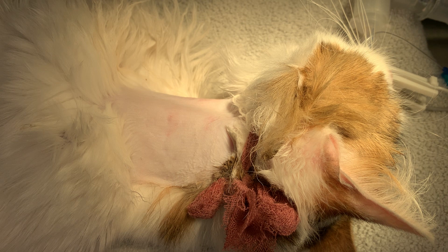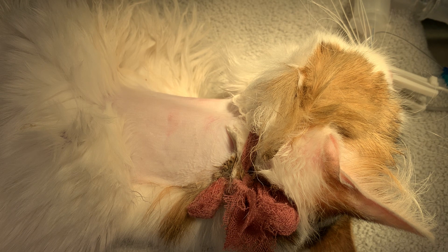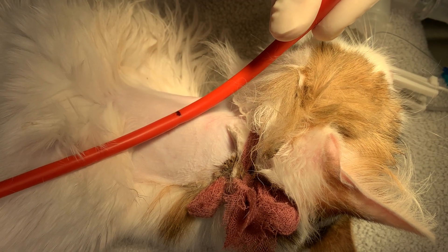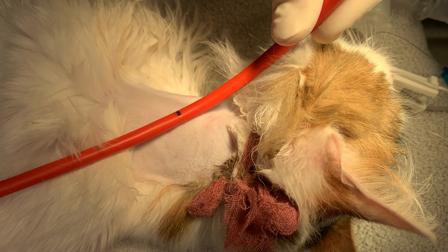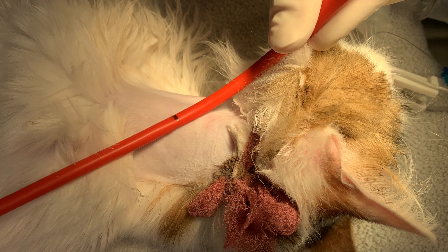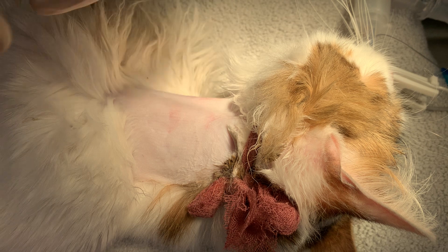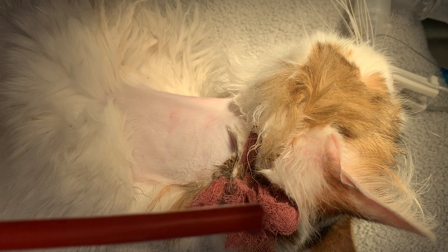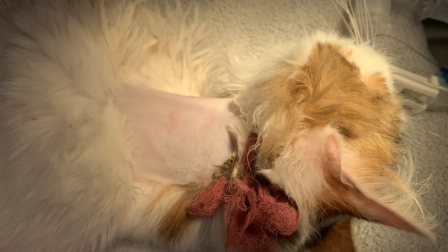Just getting a couple of things ready here. We're going to place a 20 French red rubber catheter — it's a nice big tube, so very unlikely to get clogged. I've measured it from the proposed site of our stoma to about the 9th or 10th intercostal space. The goal is to not necessarily put it in the stomach unless we have some indication, which we don't — he's not regurgitating or anything. I've cut the end off of the tube; I don't like to leave the little blunt end, as this is less likely to get clogged.